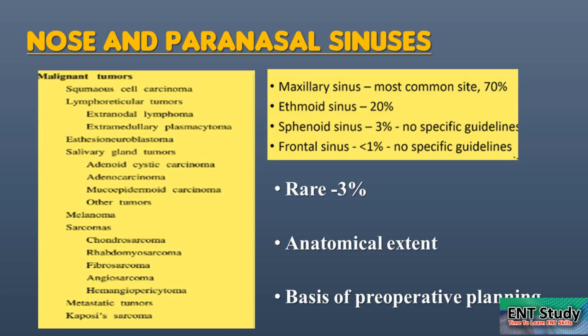Sorry for this grand slide. I just showed you the normal anatomy first. Now, when our CT was intact, 50% of my work used to be head and neck malignancy.